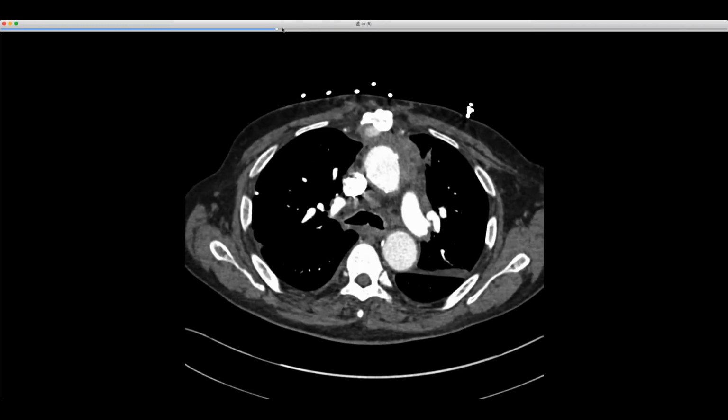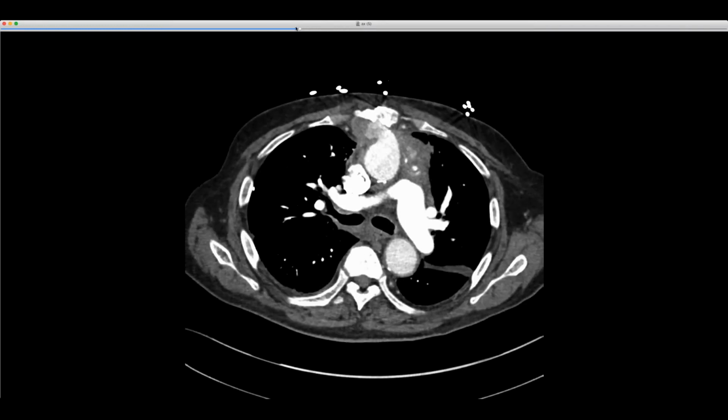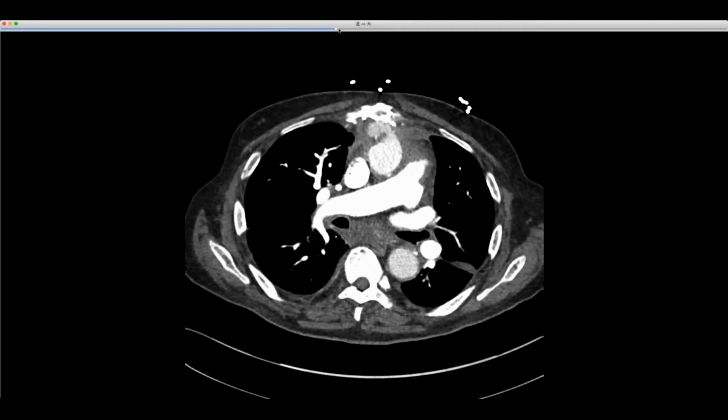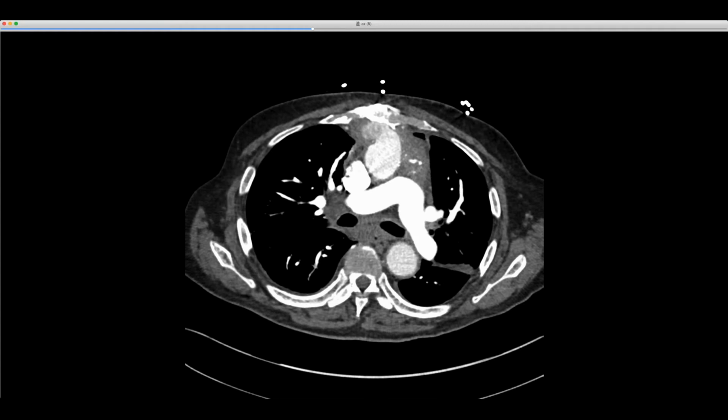The interesting thing is they put an endostent in the ascending aorta, and I don't have the particular study, but we had already put an endostent and it was still leaking. So here's an interesting procedure or device that I was unaware of. Let me bring this up, sorry, I'm fighting with my machine here. The wheel is spinning. Let me see if it's having a little bit of malfunction.